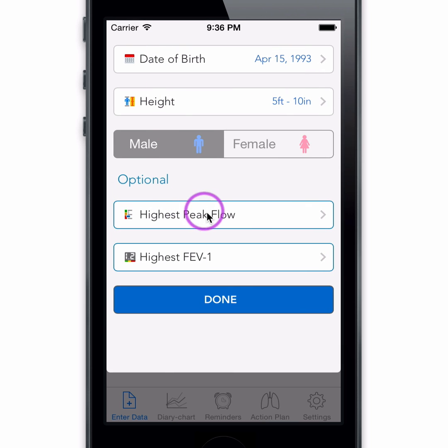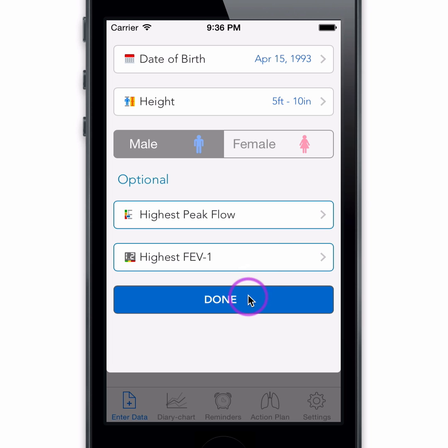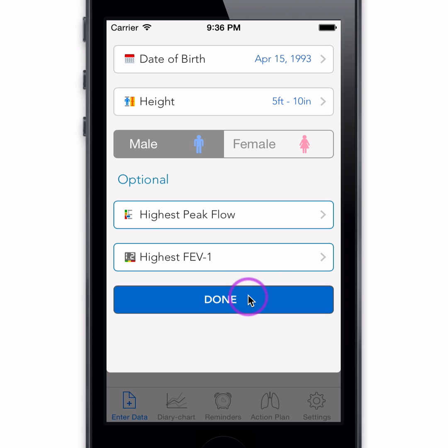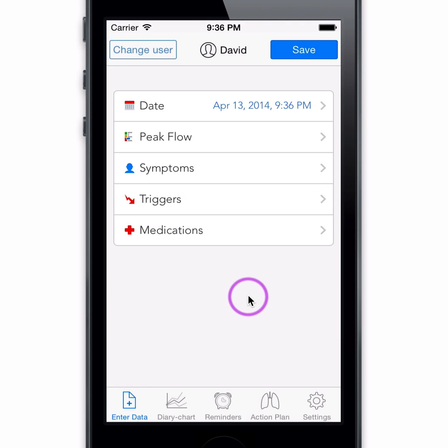If you know your highest individual peak flow measurement or FEV1 value, you can enter it here. You can now start tracking your asthma diary.